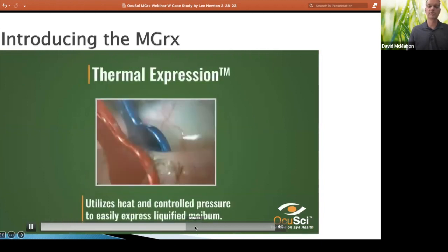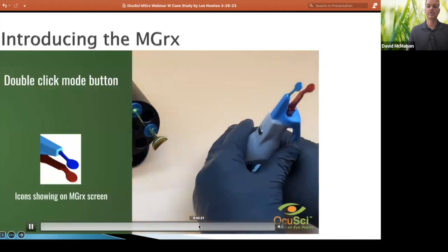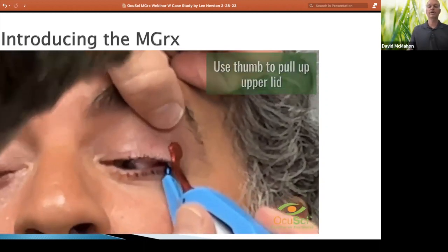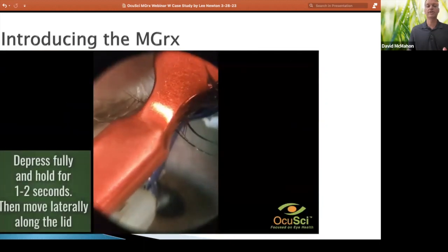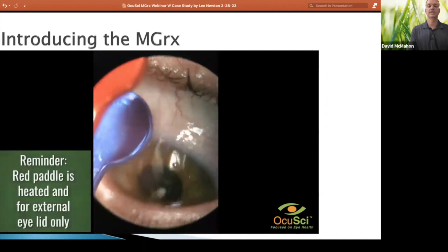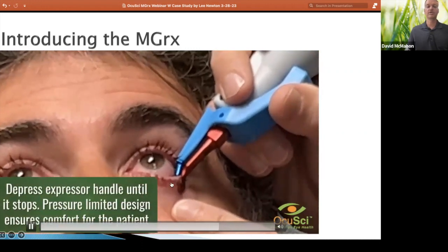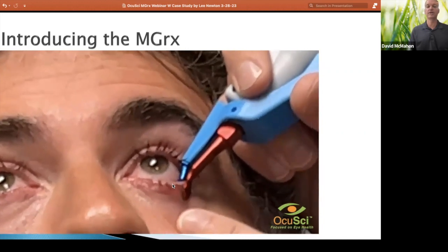Now we'll move on to expression. We're going to go ahead and load that instrument as well, and apply the anesthetic drops again — it's been six or seven minutes since the first drops went in. You can access both the upper lid — he's just kind of pulling up the lid there — and depress and hold. The pressure is controlled; you can't put more than about 10 psi on that eyelid. It locks out such that you can't exceed that. You can see the angle of those paddles. He's doing the lower lid now, and for the upper lid, you would just flip the device around and the angle would be correct for that as well.